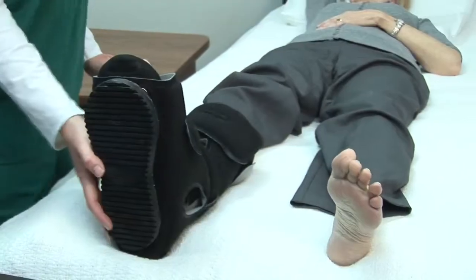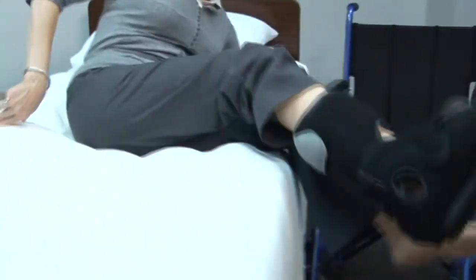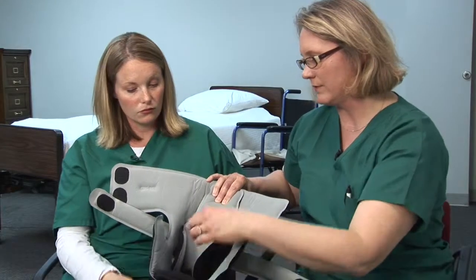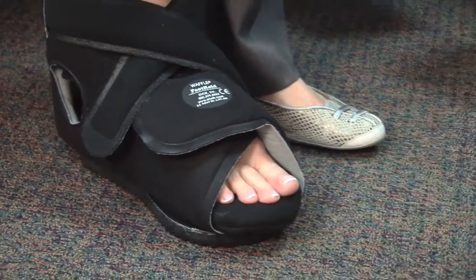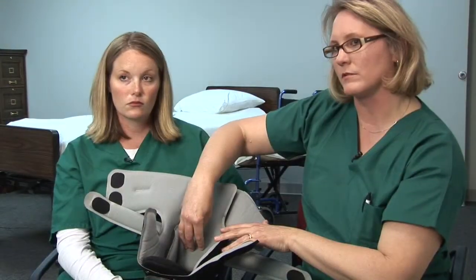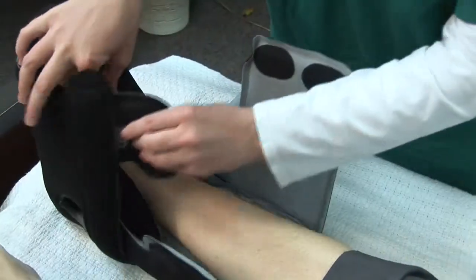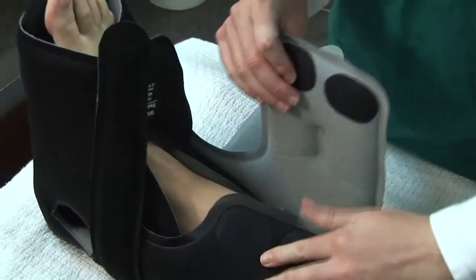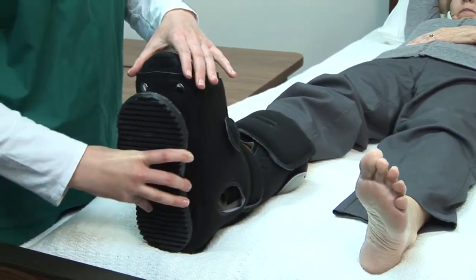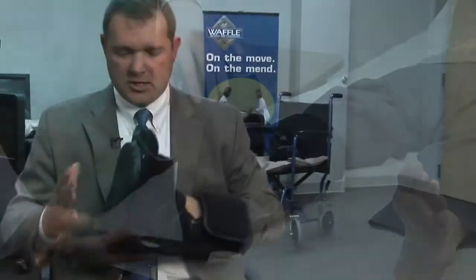So if you want to go ahead and sit on the side of the bed. What happens sometimes is a patient will push down into what we call plantar flexion, and because of that, in the devices that have a harder shell, their heel actually slides upward. And so because of the rigid nature of the shell, they will develop an ulcer on the back of their ankle.